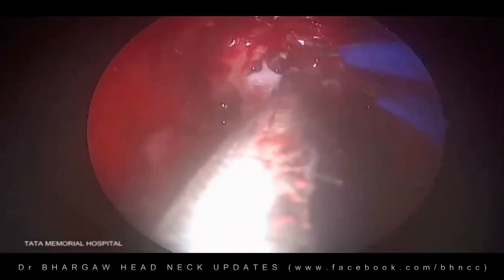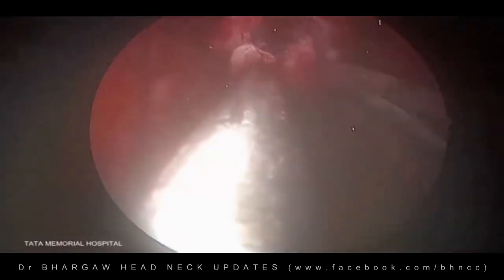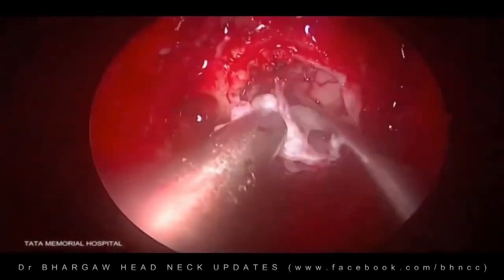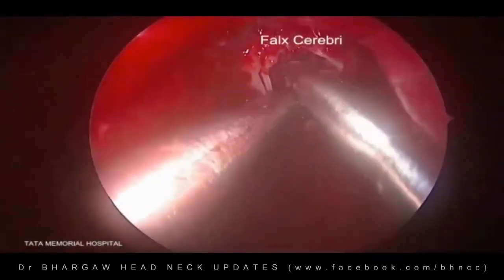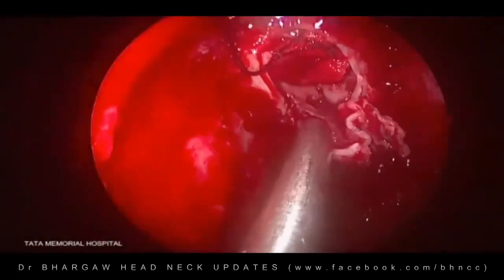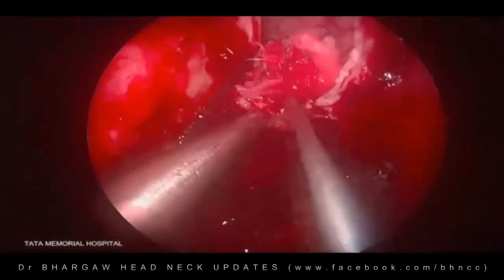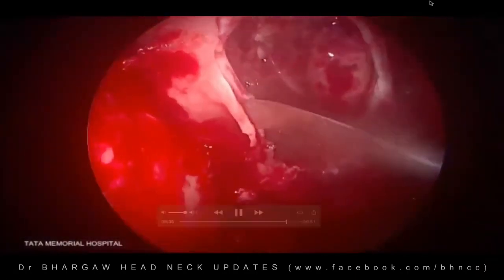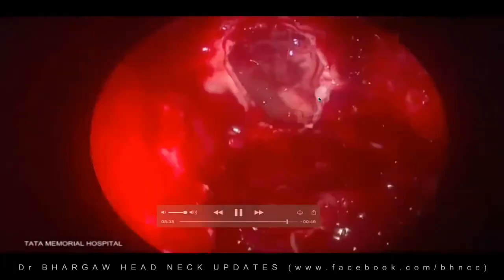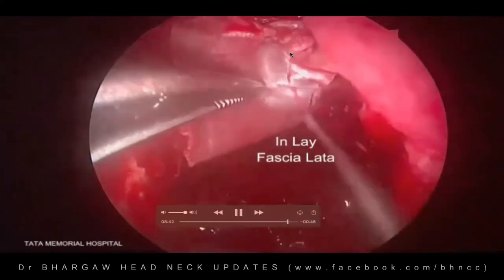And here we are just dealing with the falx cerebri area, the falx of the dura there. So that needs to be slowly dissected out. You'll have arteries at the base there that need to be protected. The olfactory bulb was removed on the ipsilateral side. Now the disease was removed here. And now we are seeing the edges of the dura, which was sent for frozen, and it was negative, and that's when we started reconstructing.